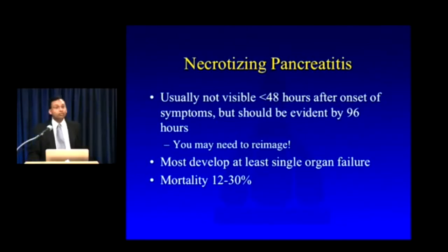So there is nothing wrong with re-imaging patients who have what looks like edematous pancreatitis at presentation, but are clinically worsening, are not getting better, their lipase is not trending down. It's very important to re-image these patients because you may see evidence of pancreatic necrosis on the follow-up. Typically that follow-up, if you do it at about 2 to 4 days, is when you're most likely to identify evidence of developing necrosis.